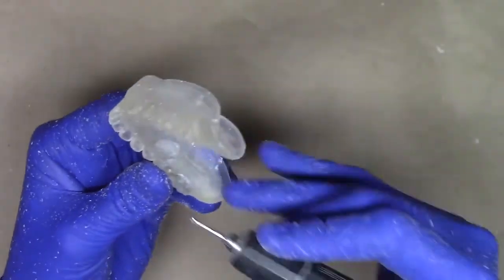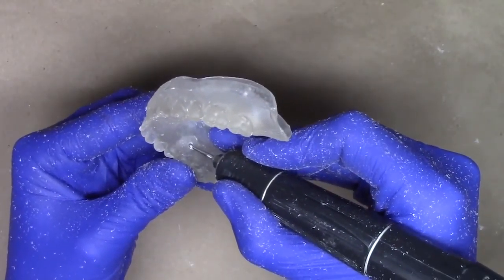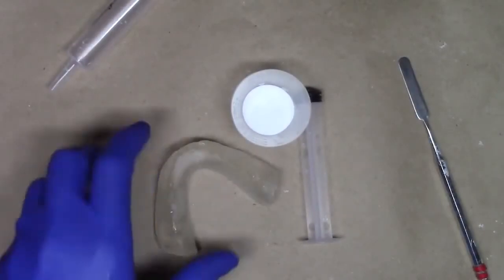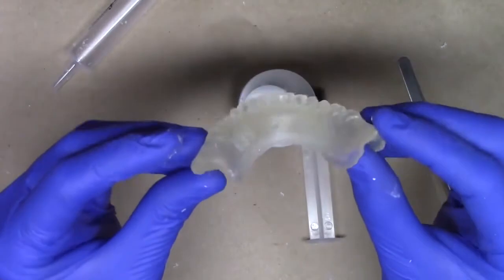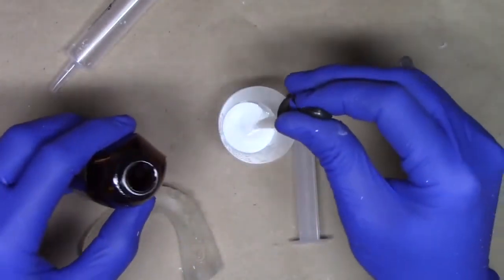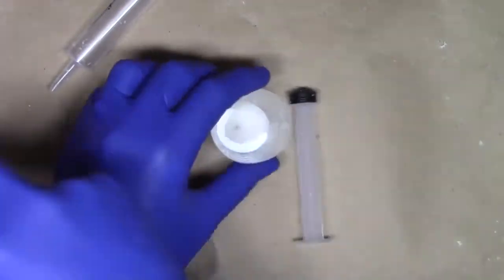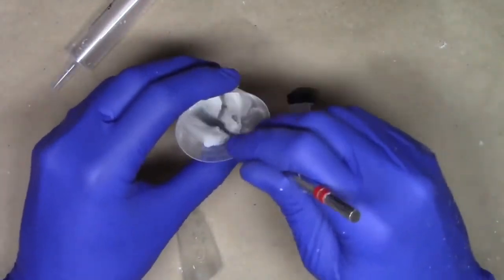Pretty simple to fix. Just punch a hole through the side of the void, and I'm going to fill that in with a little bit more clear resin. So to fill in some of these little tiny voids that you might occasionally get during the injection molding process, it's pretty simple to do. Just grab a little bit more powder, mix in some fresh monomer, and your cleaned up Monoject syringe. I typically take that same Monoject syringe, put a little bit of air pressure behind it, and it cleans up pretty easily.